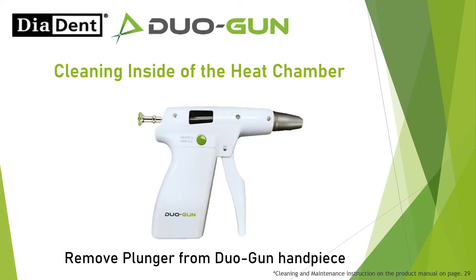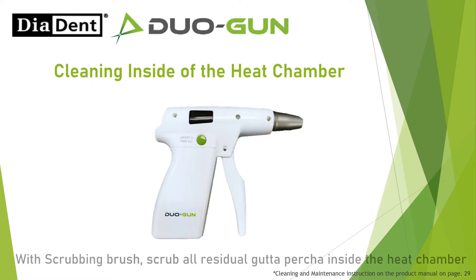Remove the plunger from the Duo Gun handpiece. With the scrubbing brush, scrub all residual gutta-percha inside the heat chamber.